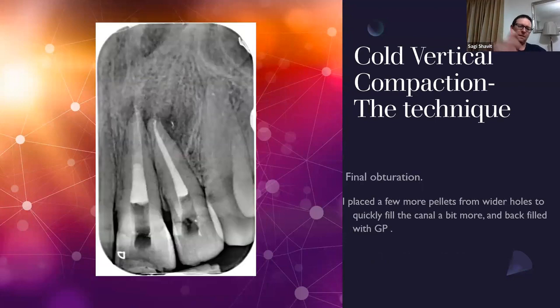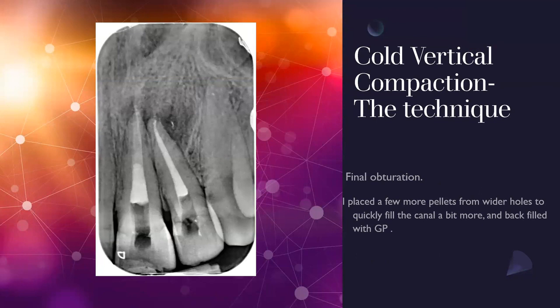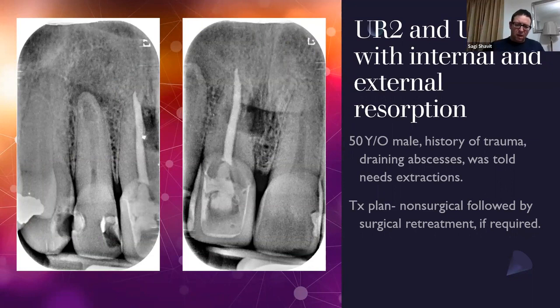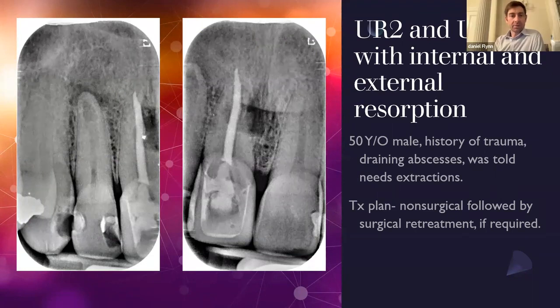Backfilled, after that, you can use your warm vertical compaction technique, bioceramic sealer, if you'd like to inject it, whatever makes you happy. That's fine. Let's have a look at a couple more cases. Is that okay? Yeah, go for it.